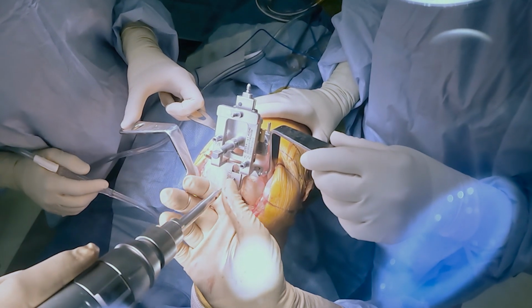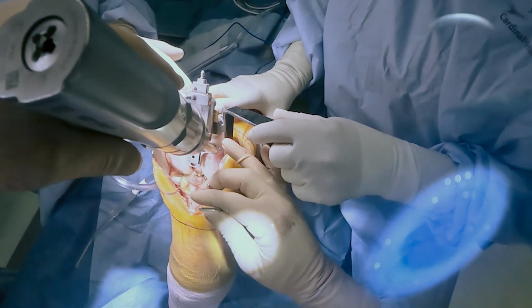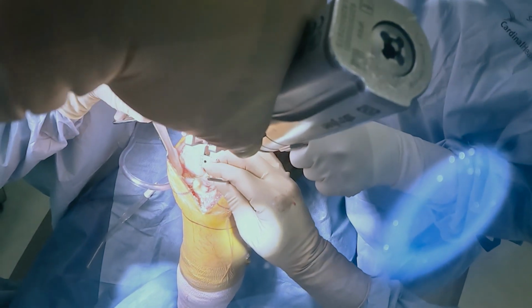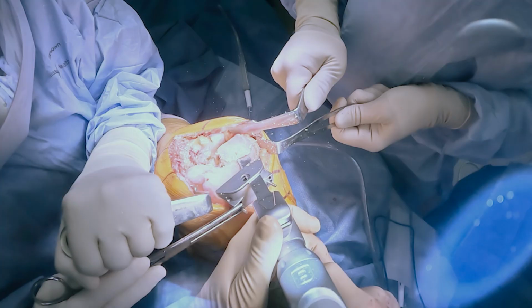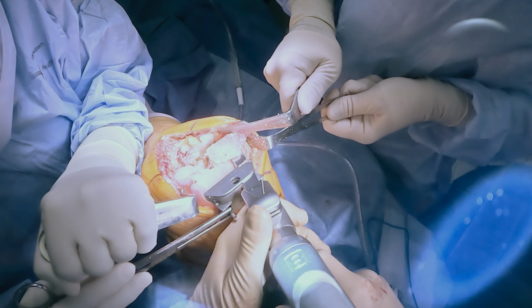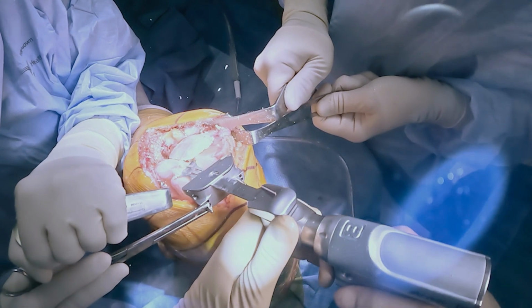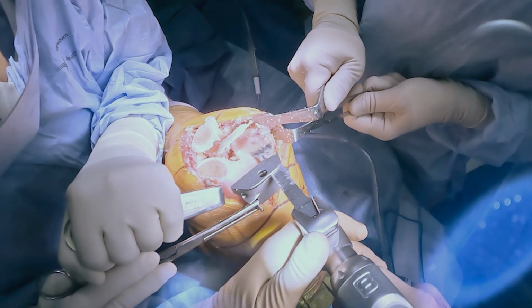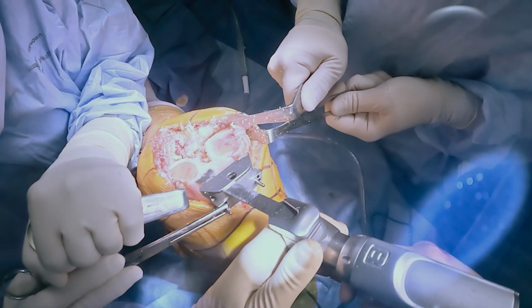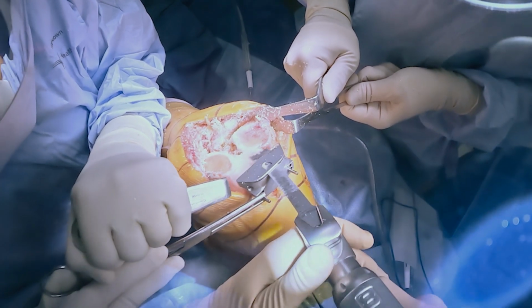Once the resection is set, we will pin the distal femoral cutting block. This is a pretty straightforward workflow for me. It really has no difference from manual instrumentation and doesn't slow me down at all. Once the distal femoral cutting block has been pinned into place, I'm removing the distal femoral surface with an oscillating saw at our preset mechanical axis. Here it's very easy to use, very similar to the mechanical instrumentation per the provider you use.